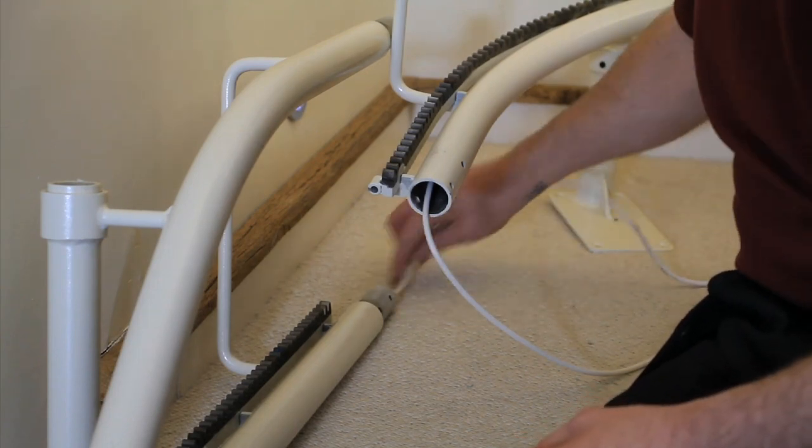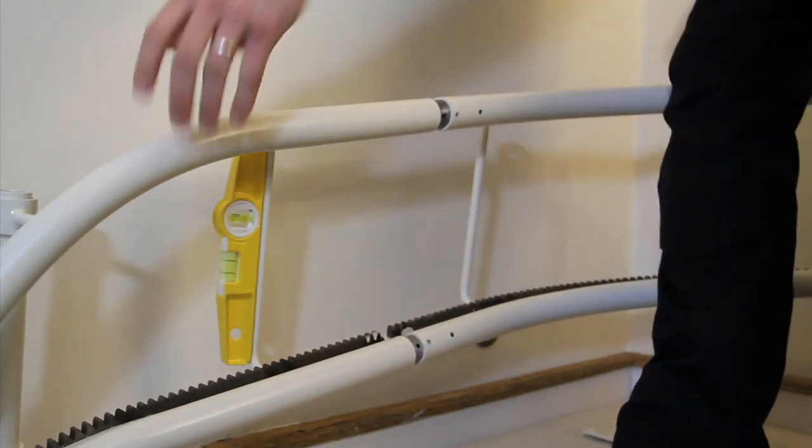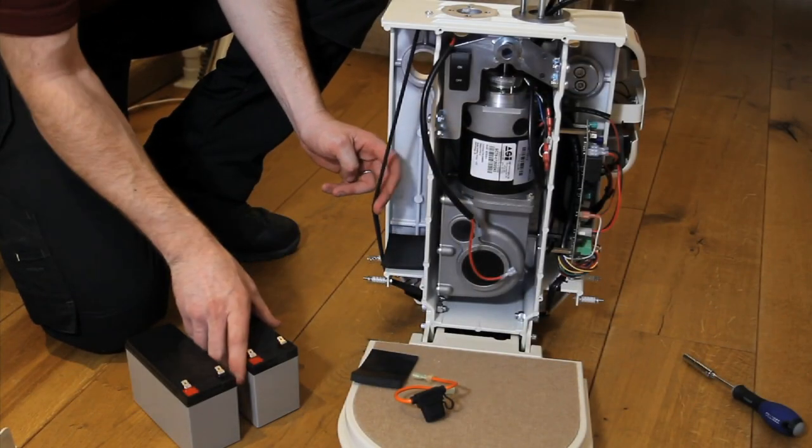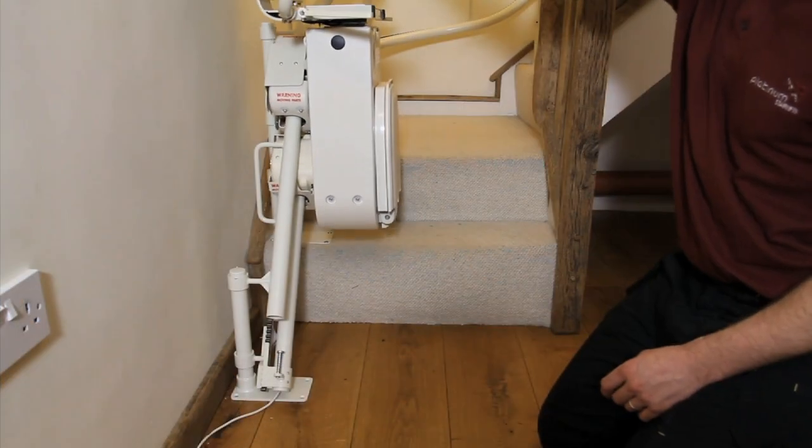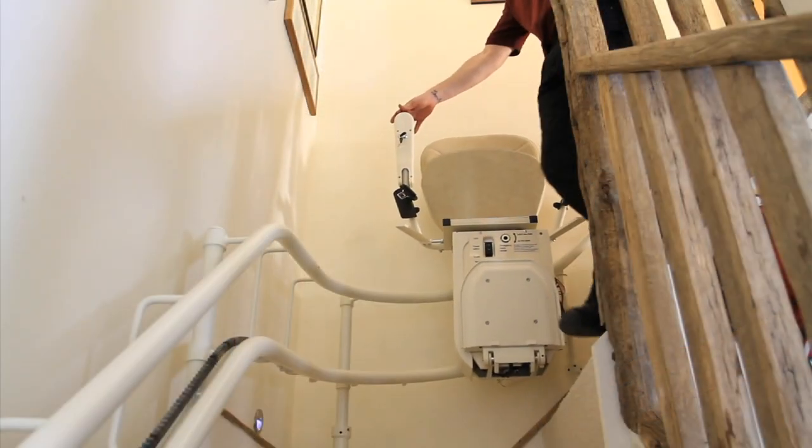Throughout the video we will show you how to fit the power supply and wall controls, as well as the track installation and the preparation of the carriage and chair. It will also show you how to safely mount and program the carriage, along with a series of basic checks to ensure the safe installation and easy use of a Platinum Curve Stairlift.